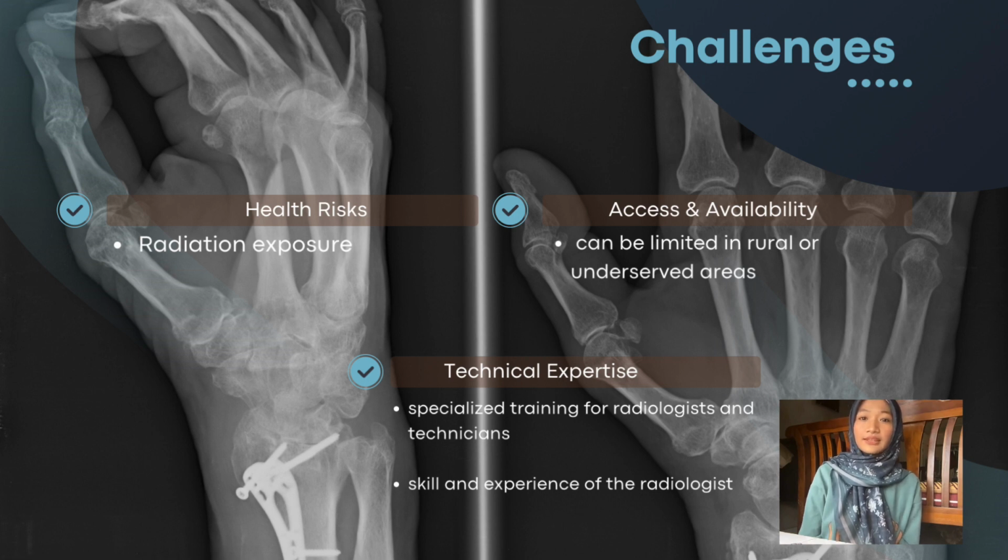Last from me, technical expertise. Operating X-ray machines requires special know-how. Healthcare professionals like radiology technologists need training to use these machines safely and effectively. They learn how to position patients correctly, adjust machine settings for different types of scans, and follow safety protocols to protect themselves and patients from radiation.